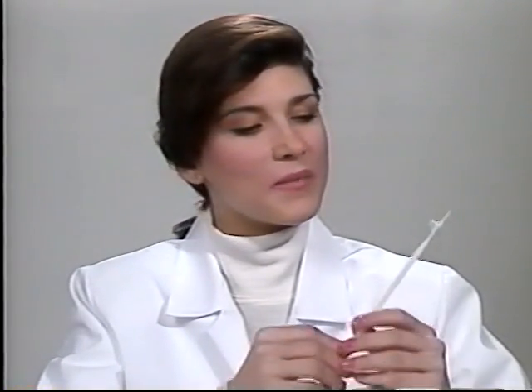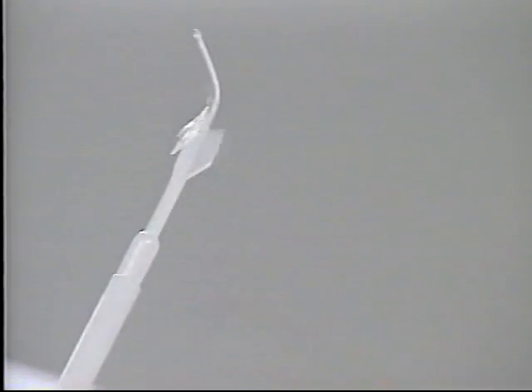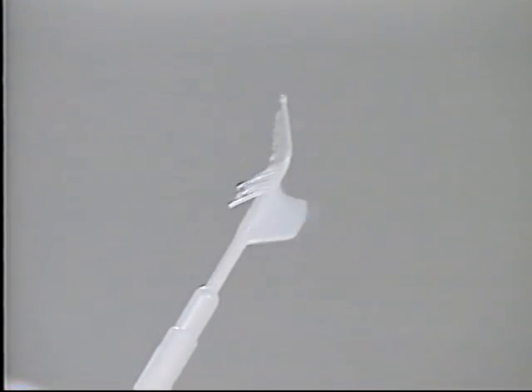For cervical cell sampling, the design of CellSweep is optimal for cell harvest and cell transfer. CellSweep has the capacity of simultaneous endo- and ecto-cervical sampling. It is soft, malleable, and adaptable to individual cervical variations. This device samples the entire T-zone while remaining in close contact with the cervix.